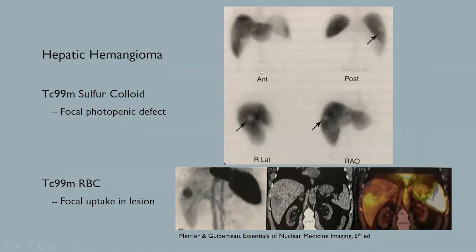In this example, sulfacolloid imaging shows a focal photopenic defect in the right hepatic lobe. An additional study with labeled technetium-99m red blood cells shows focal uptake of labeled red blood cells in that lesion. SPECT-CT imaging shows a hypodense lesion in the right hepatic lobe taking up labeled red blood cells, compatible with a hepatic hemangioma.